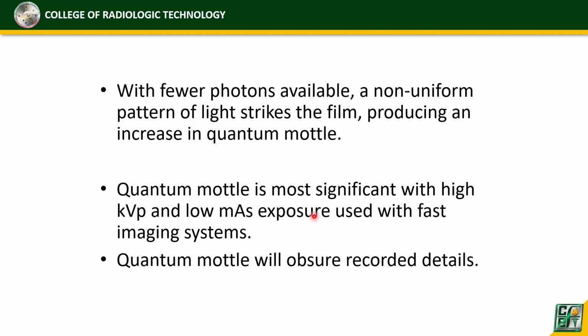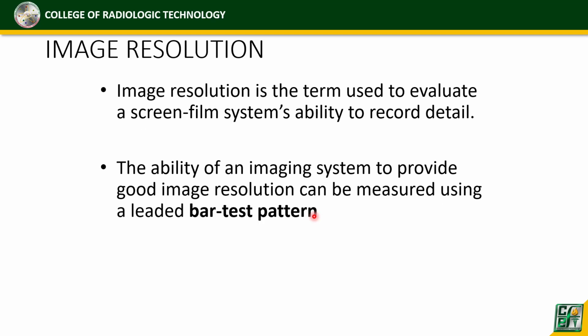So quantum mottle is significant with high kVp and low mAs exposure used with fast imaging systems, particularly the rare earth systems. Okay? And then quantum mottle will obscure recorded details. So kaya kailangan ay gumamit ng fast na film screen system.